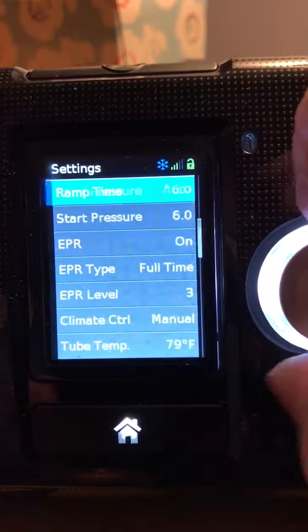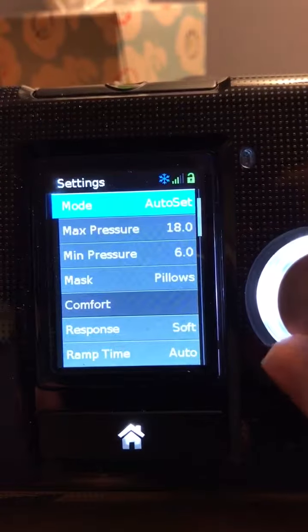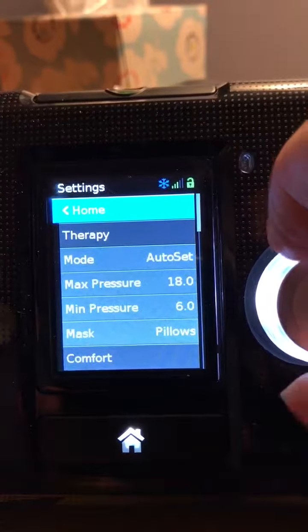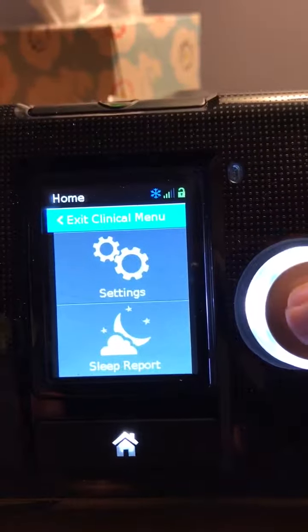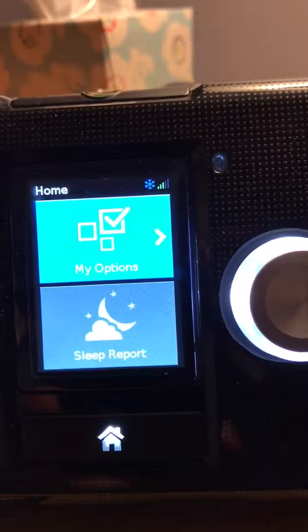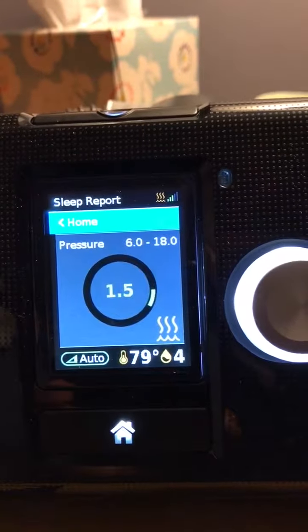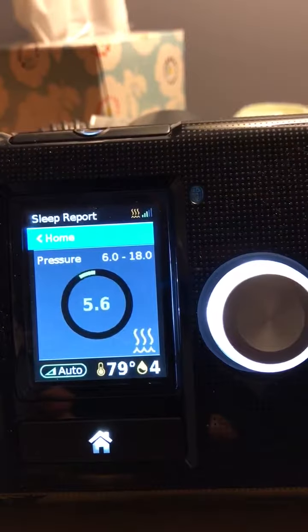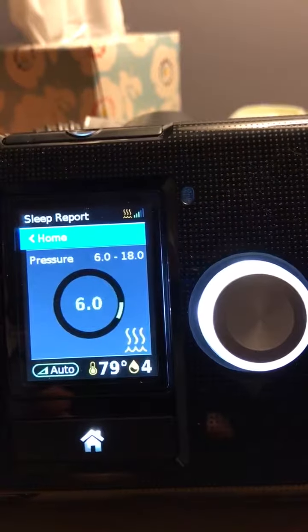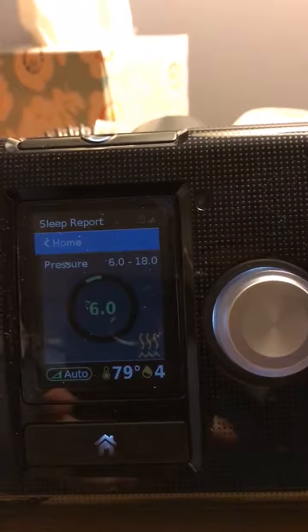So you go back up, home, turn the knob, exit. And there it is. Once you start your machine up, it's going to go to 6 now instead of 5. And like I said, that helped me a lot.